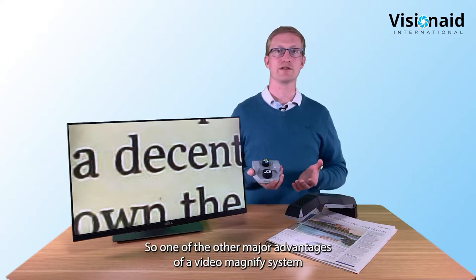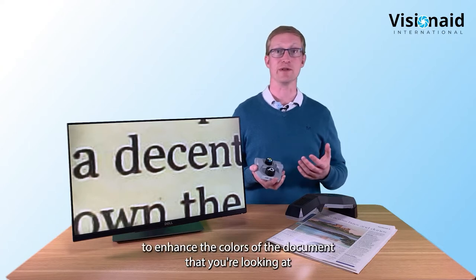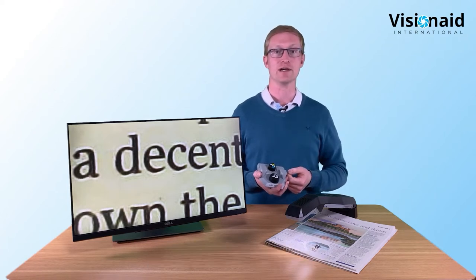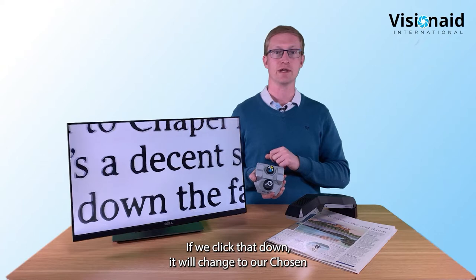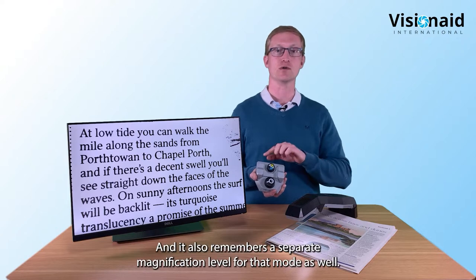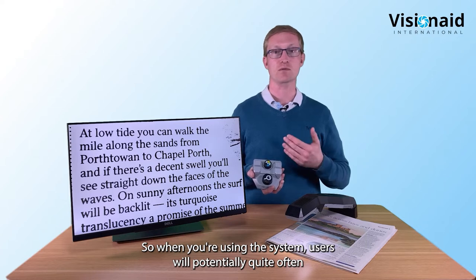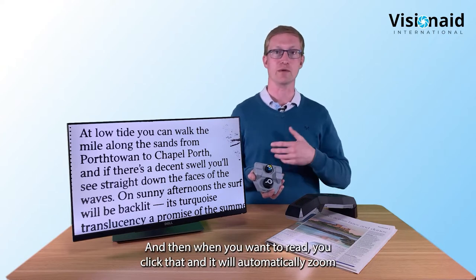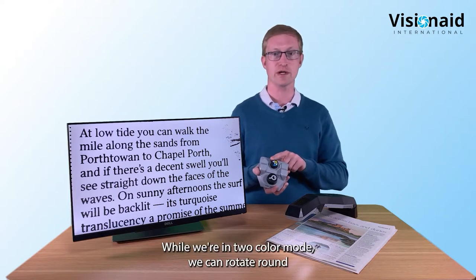One of the major advantages of a video magnifier is it allows you to enhance the colors of the document. The top dial lets you change color modes - click it down and it switches to your chosen two-color combination. It also remembers a separate magnification level for that mode. Users often have a low magnification for photos and page overview, then click to automatically zoom to their preferred magnification for two-color reading.